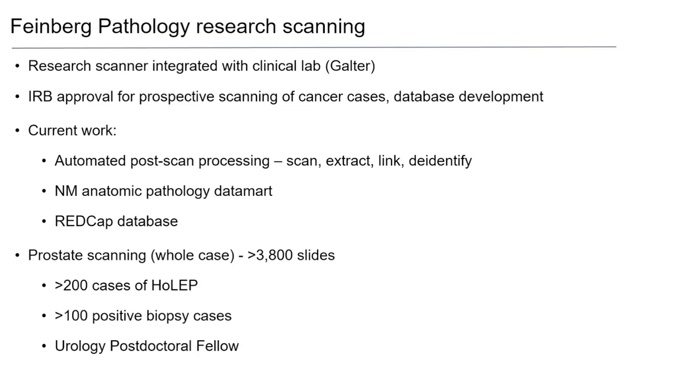We're working with NM on an anatomic pathology data mart. This will allow us to get structured data that's going to be very, very useful for describing what's in these slides. And that's, I think, going to give us a really big advantage in this area, being able to scan at volume and then to have this structured data at our fingertips. And then all of this will be integrated through the platform I mentioned before and using a REDCap database.